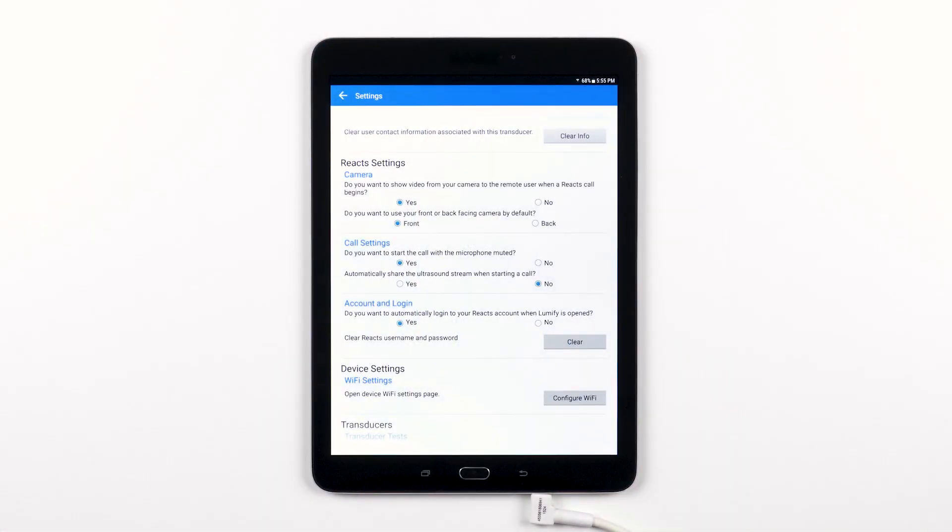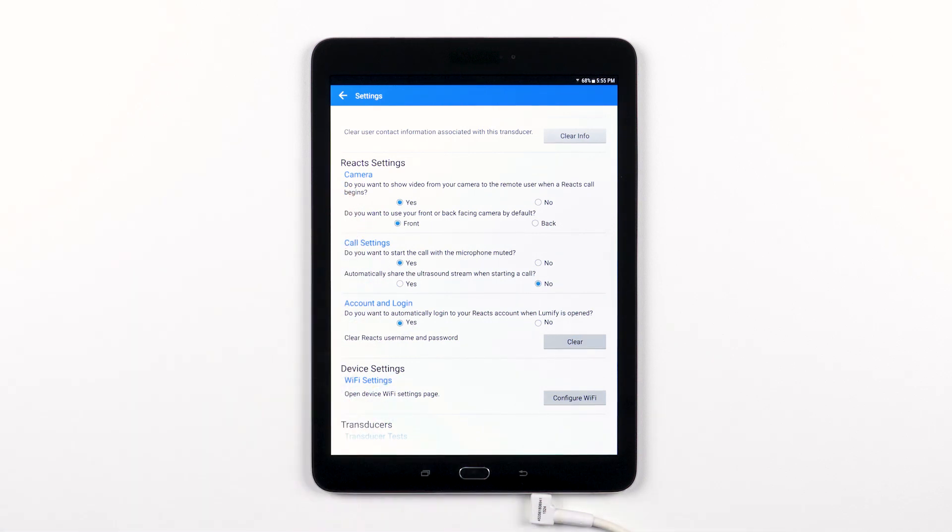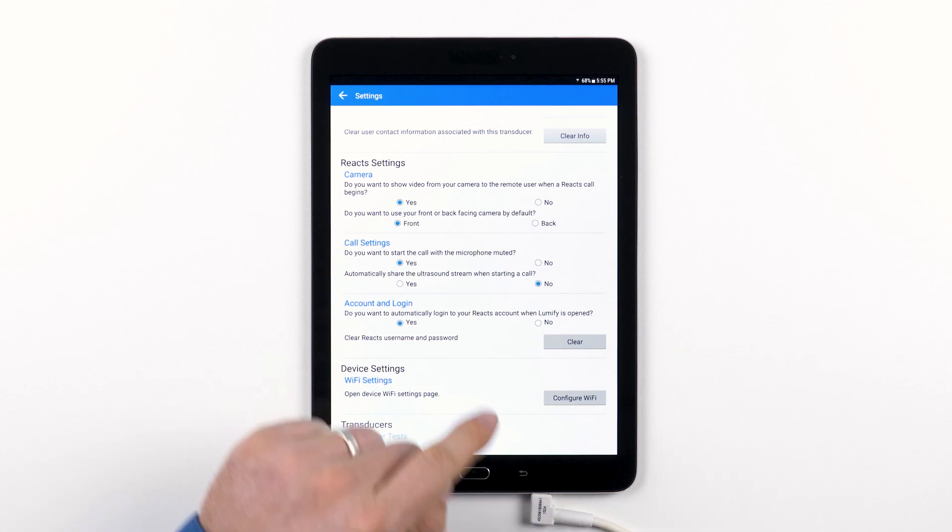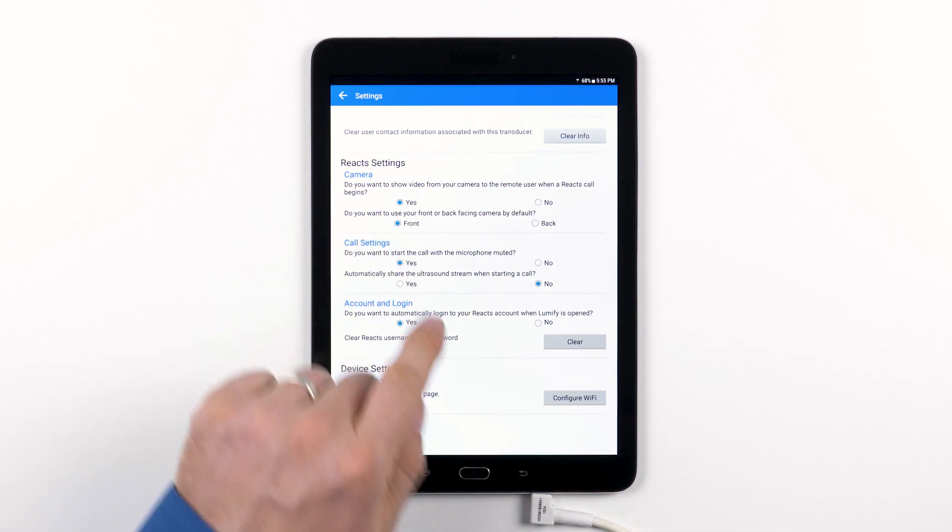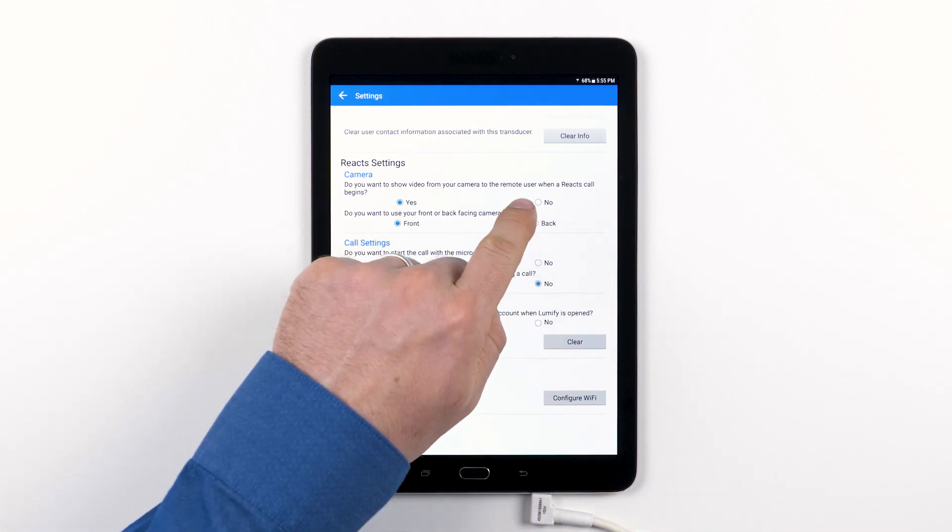The first setting deals with whether or not you want to have your camera activated and visible to the remote user as soon as the call is placed. If you want your camera to be active as soon as the call is placed, choose yes; if not, choose no.